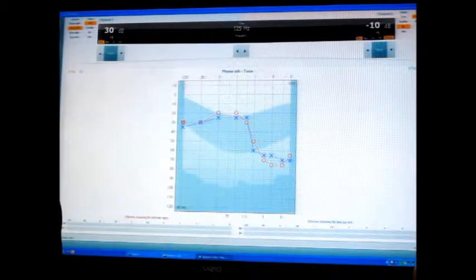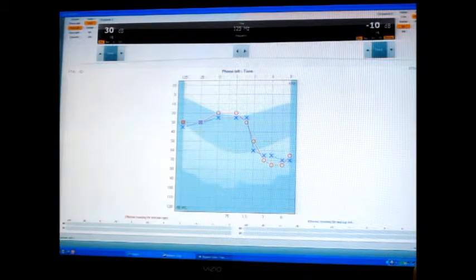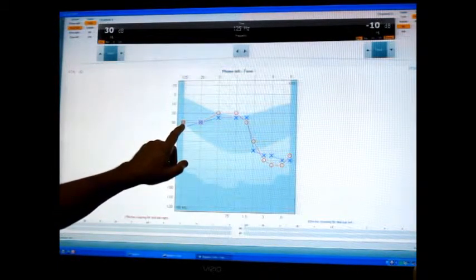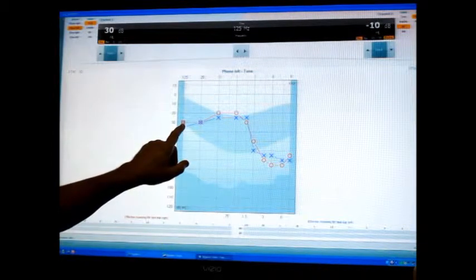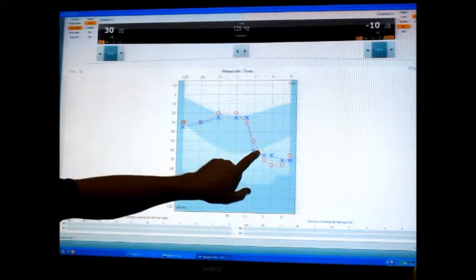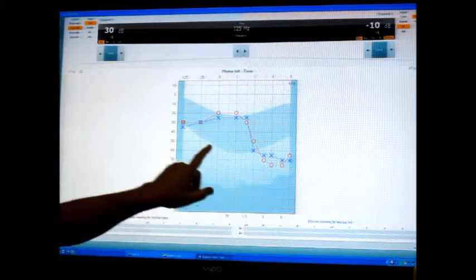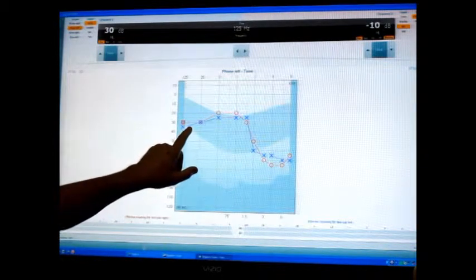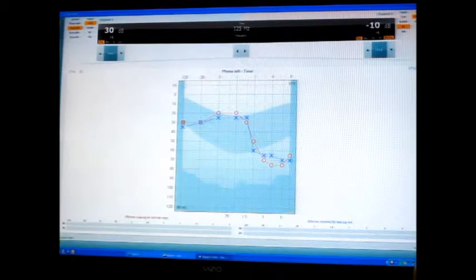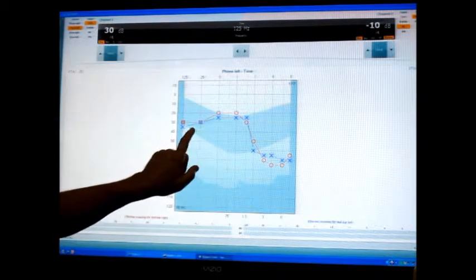So let's walk through an explanation of the hearing results. What we see on the screen are a series of red circles and blue X's. The red circles are tracking the hearing in your right ear and the blue X's are tracking the hearing in your left ear.